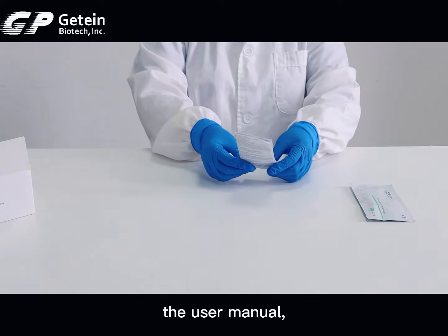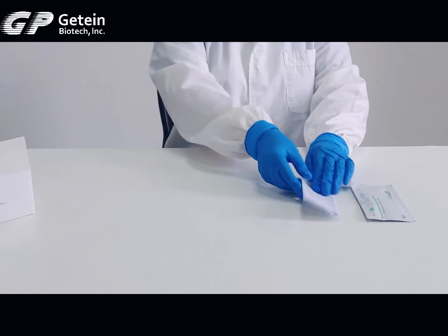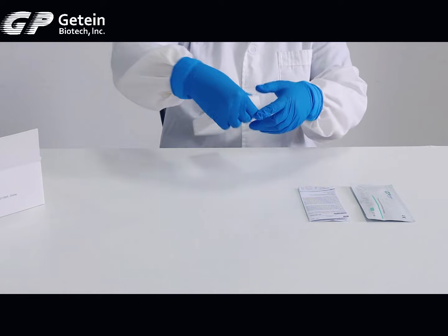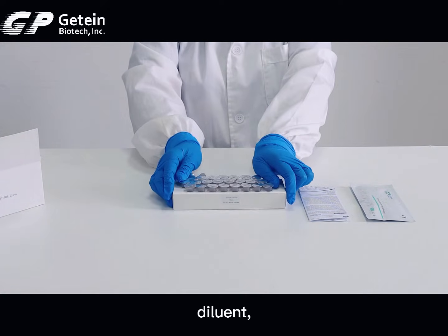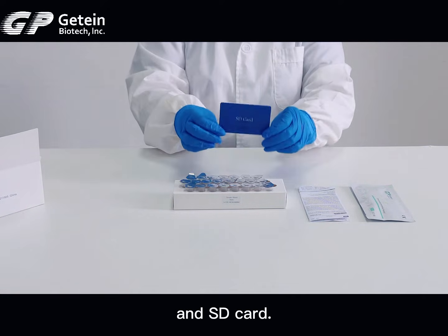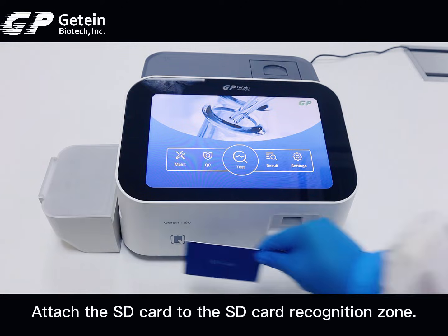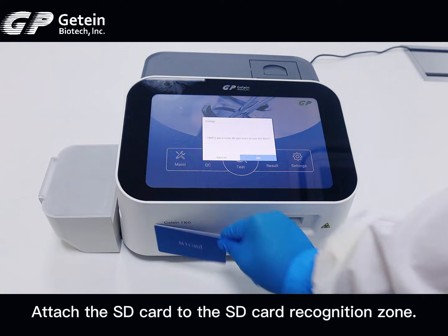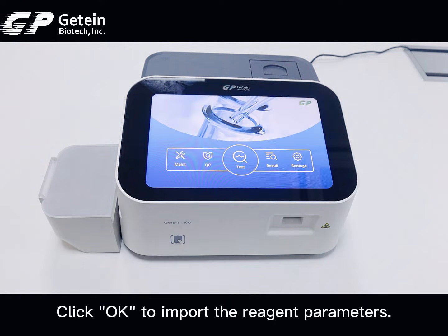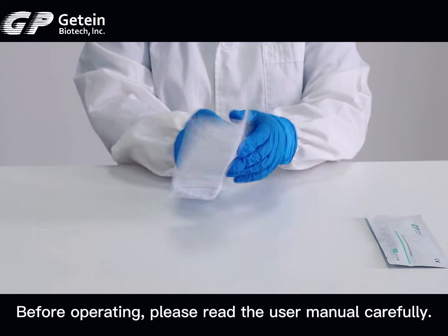The Reaction Box also contains the User Manual, Diluent, and an SD Card. Attach the SD Card to the SD Card Recognition Zone and click OK to import the reagent parameters. Before operating, please read the user manual carefully.